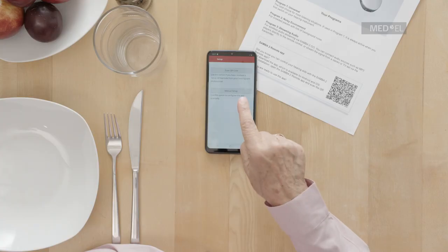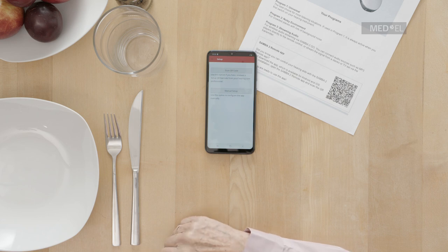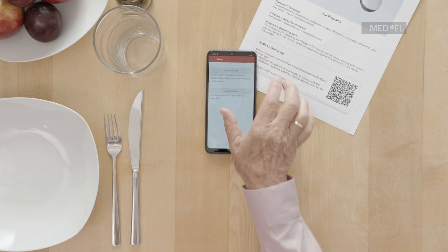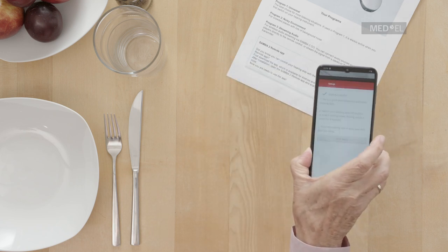There are two types of setup. To set it up manually, select Manual Setup and follow the instructions on the screen. If you have a setup QR code from your hearing care professional, select Scan QR Code.